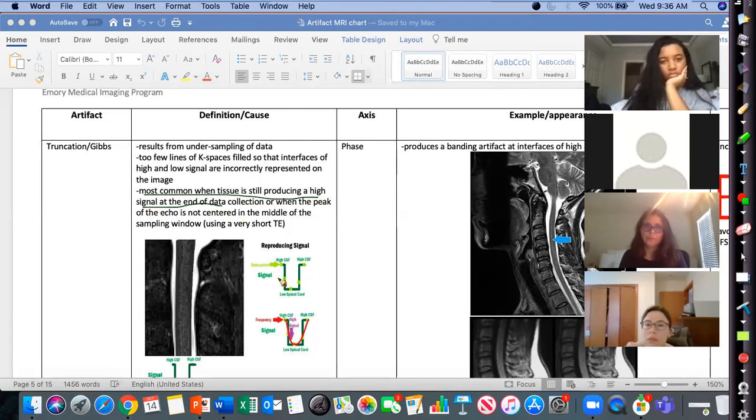All right, so here, most of the time we think of how we're collecting data as very square, you put that signal into a box, and it's easy for the system to collect it and put it into your image. But what's more likely is that, remember, we have these RF bands that we're collecting that are very rounded. And we're trying to put these very rounded RF bands into very square pixels, right?